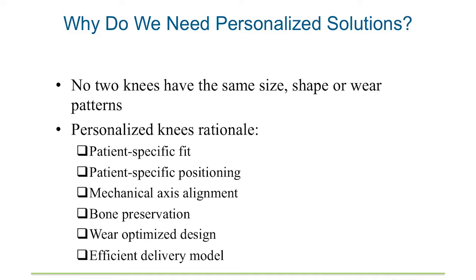One of the difficulties we face is that all patients are different shapes and sizes, and so deformities are very different, and the wear pattern is different. As I said, everyone's a different shape or size, and each company produces a certain prosthesis with a range of sizes that we can use, maybe 5 different sizes, but even so, within a given size range, we sometimes have to choose, for example, between a size 4 and a size 5, and it's not a precise fit.